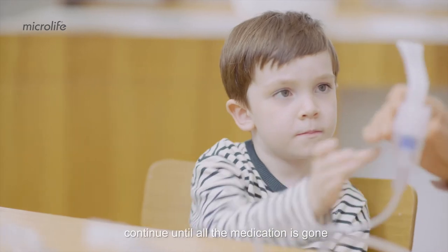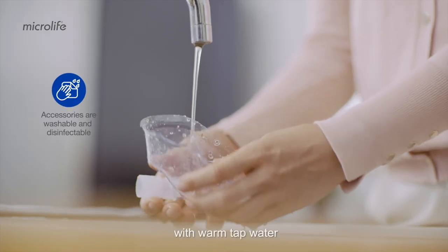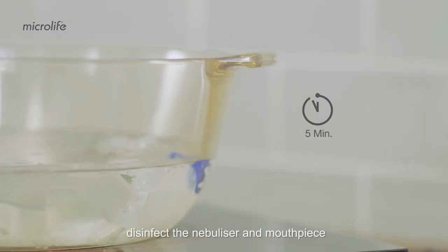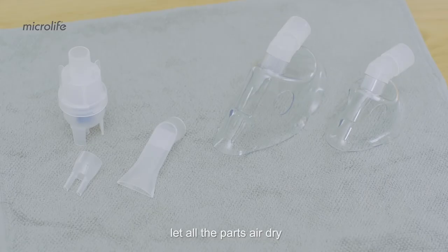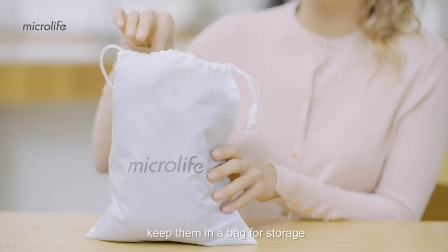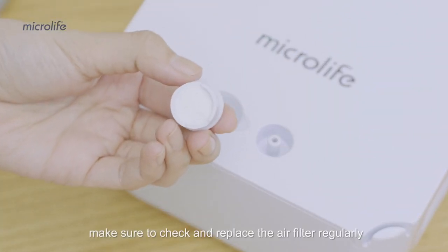Continue until all of the medication is gone. Thoroughly clean all disassembled parts with warm tap water. Disinfect the nebulizer and mouthpiece in boiling water for 5 minutes. Let all the parts air dry and keep them in a bag for storage. Make sure to check and replace the air filter regularly.